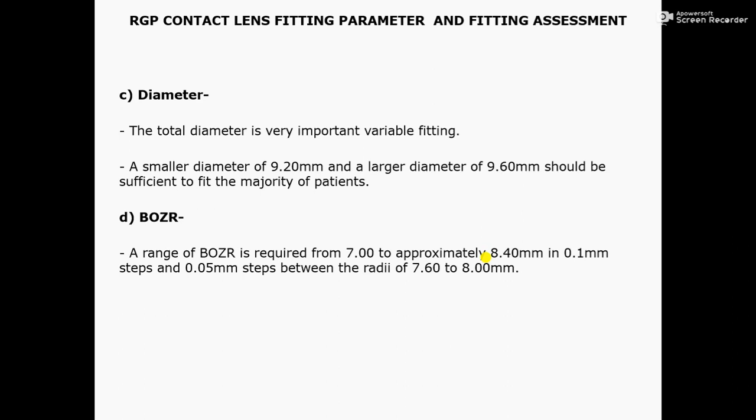Number 2. Interpalpebral, small and steeper. This lens is fitted with a small total diameter and back optic zone diameter to minimize lid interference.